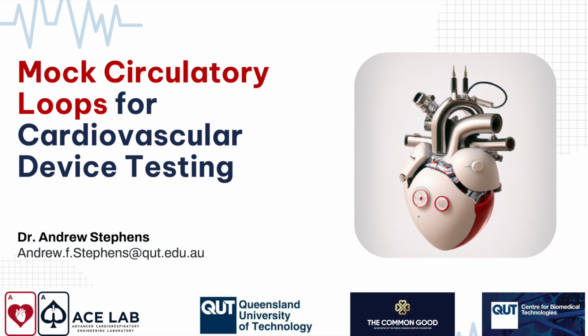However, there's a lot of research being done in that field. And the model must be always modified for your specific question. Always build and validate your mock loop for the specific question that you want to answer. And we'll talk about that as well later.